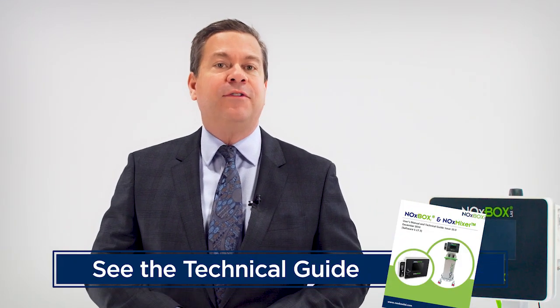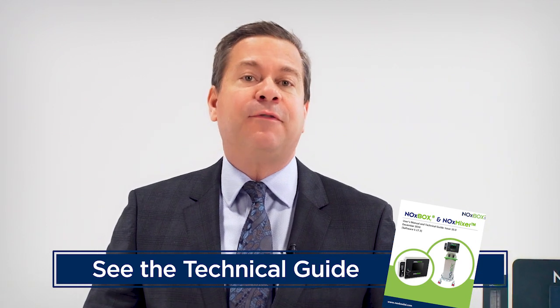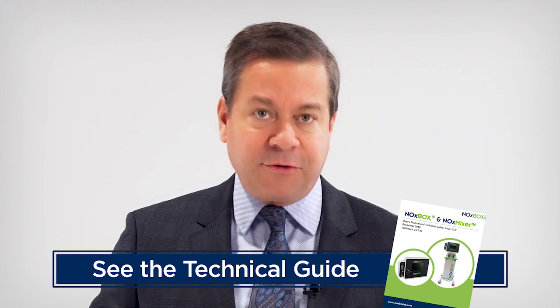You must read and understand the detailed operating and safety instructions found in the NOxBOXi and NOxMixer technical guide, including all inserts or amendments. Maintenance and repair should only be performed by a fully qualified and trained technician. The content of this video is intended to provide general information only. Read and always refer to the latest NOxBOXi and NOxMixer technical guide for specific information, procedures, instructions, recommendations, and troubleshooting.